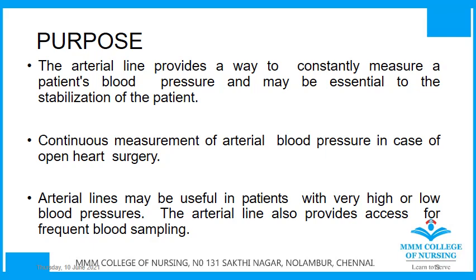In case of open heart surgery, this continuous measurement is very essential. We can know what are the ups and downs happening in the patient, either the blood pressure is high or low. This gives you a clear picture.